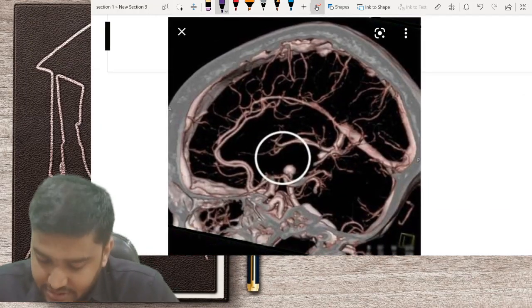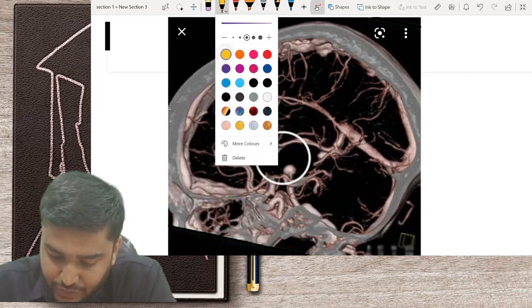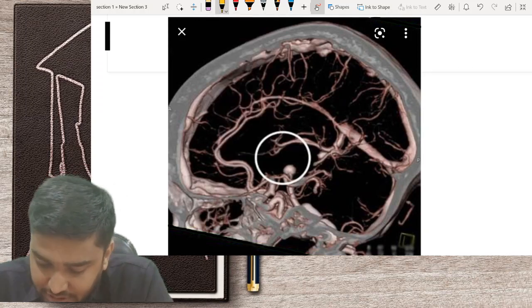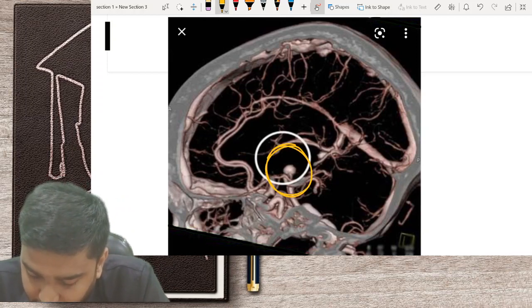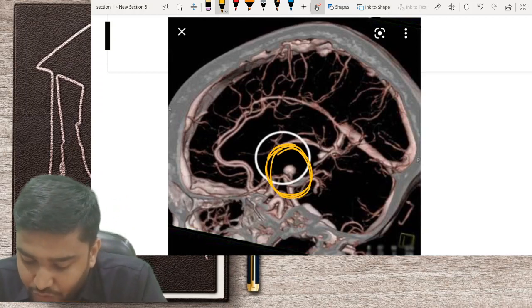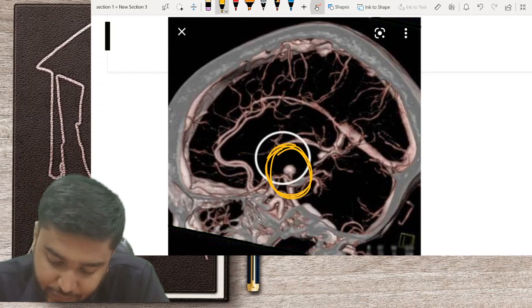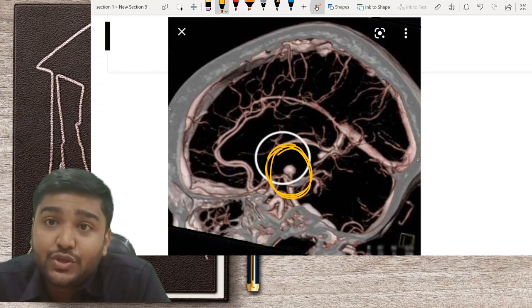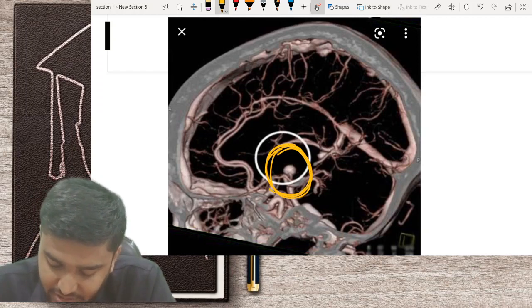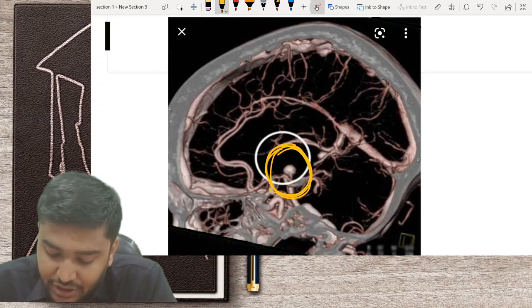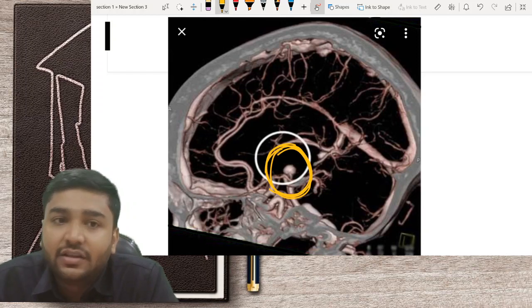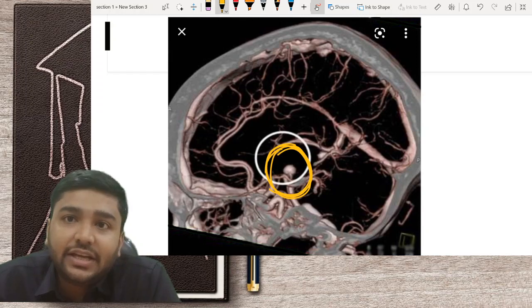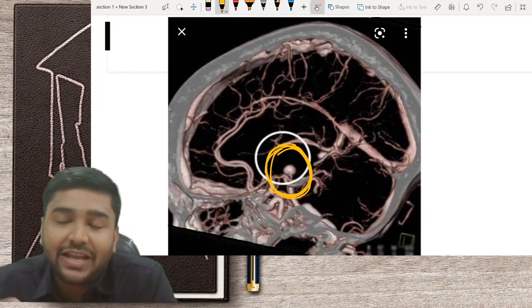This is a CT cerebral angiography showing a very nice aneurysm. You can see a diagrammatic 3D reconstruction. You should always request CT cerebral angiography with 3D reconstruction — only then can you properly plan your surgery.